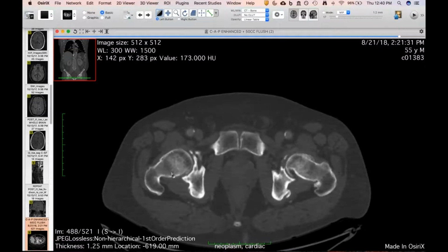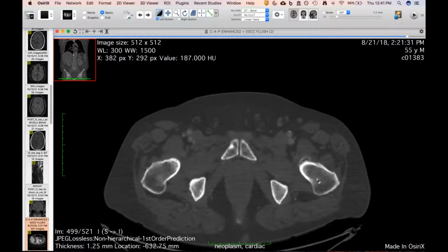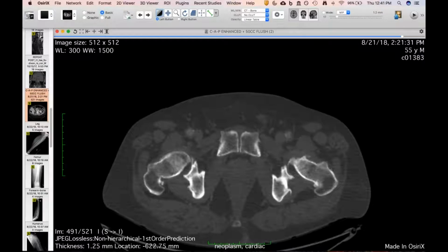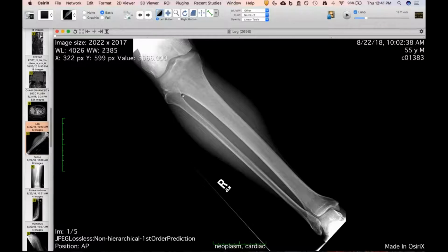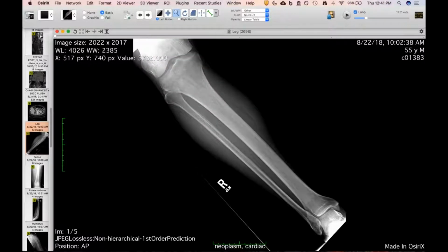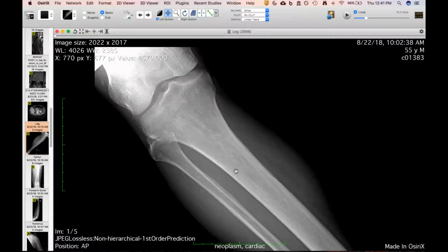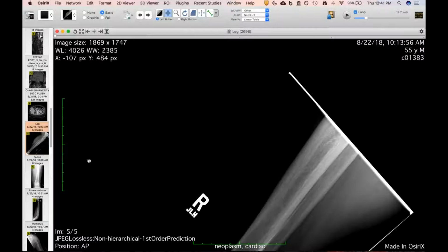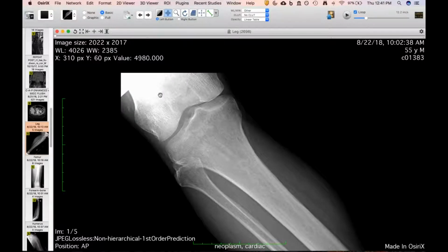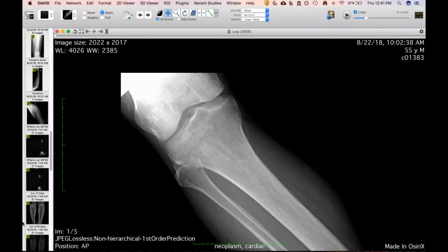The proximal femurs don't look that bad, but we said this was probably going to be... I thought this was Erdheim-Chester. So yesterday they did a skeletal survey, and I think the proximal tibia on both sides. One of our bone radiologists said yes, there's a little bit of subtle sclerosis here, which is typical of Erdheim-Chester as well. It doesn't have to be the proximal femurs. You can have a lot of stuff around the knees.